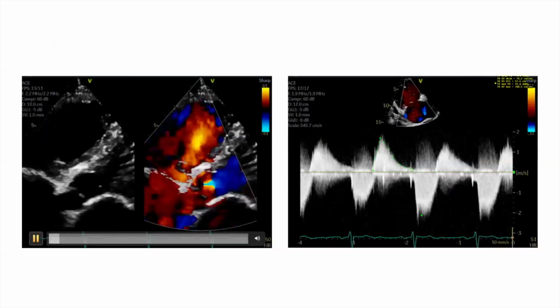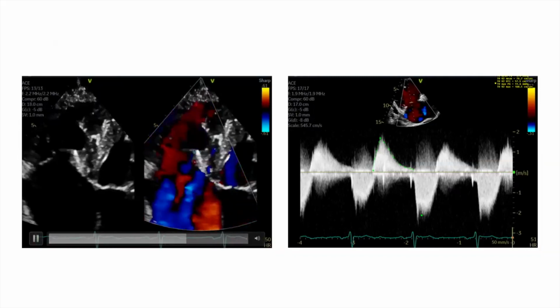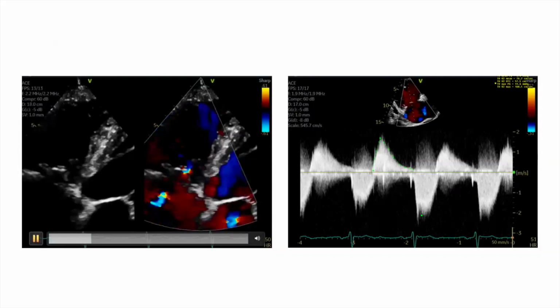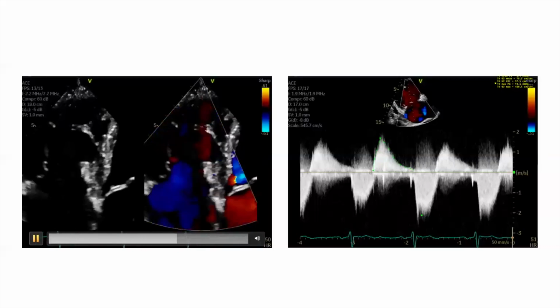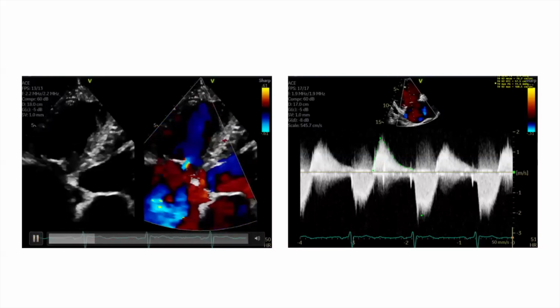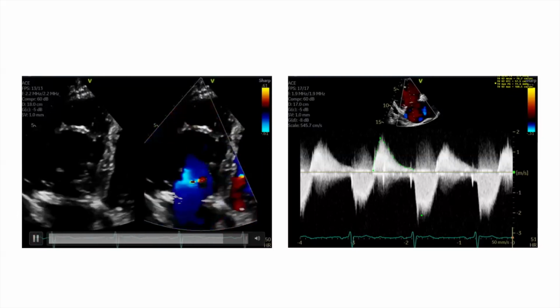So the sonographer continued on, and we are looking at a sweep in an off-axis 4-chamber view. And so this highlights one of the ways that I think is important in assessing these types of clip, which is doing multiple sweeps to look at exactly where the attachment of the device is. Here we can more clearly see, sweeping anteriorly and posteriorly, that the clip is attached to the septal leaflet, but is now not attached to the anterior leaflet.